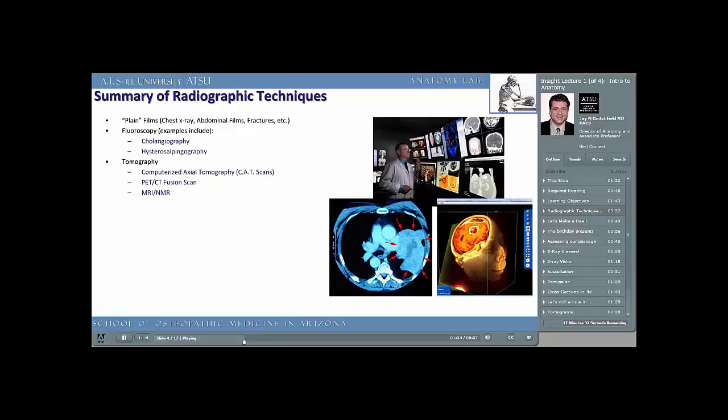As the patient lies in the CAT scanner, the X-ray source rapidly revolves around him or her, taking thousands of images in a few seconds. The computer then reconstructs these tiny pixelated images into a picture, which you see as the cross-section.